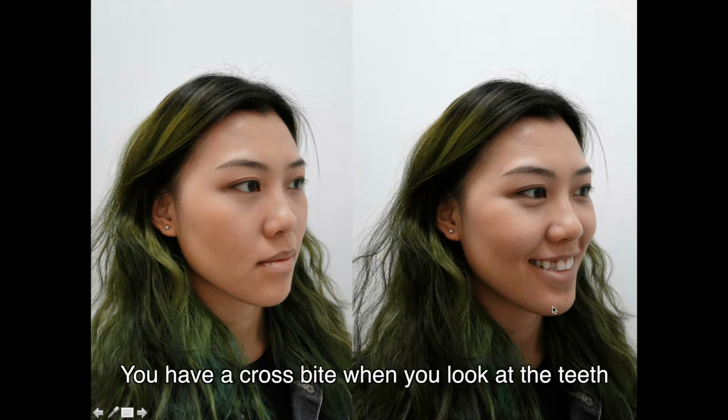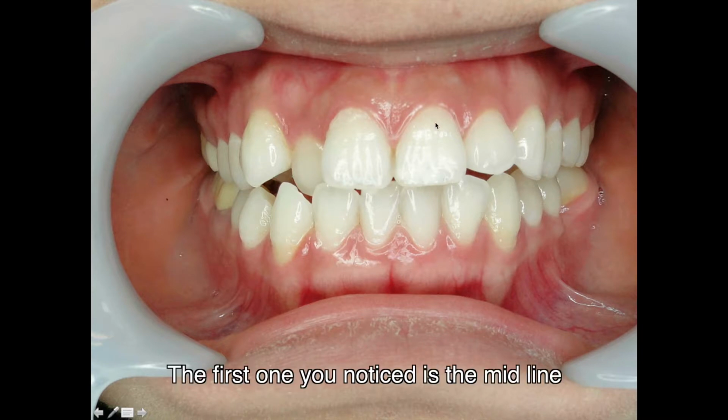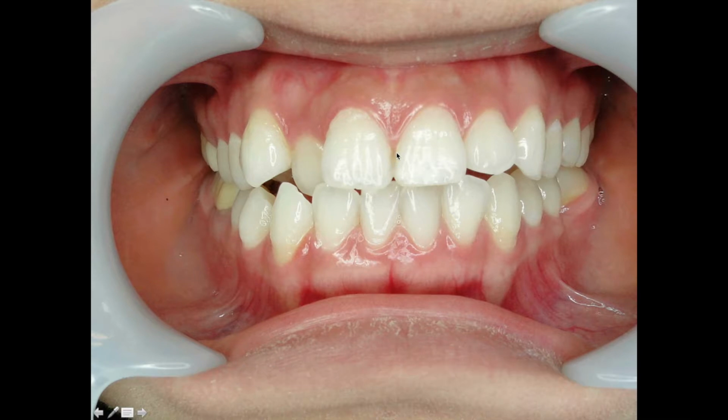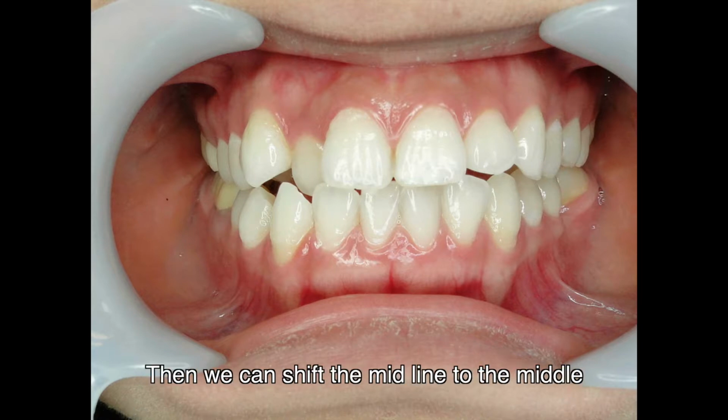We'll look at the teeth. Next. Now this is the teeth. The first one you notice is the midline. The upper dental midline is a little bit to the right. That's because of the crossbite. When we fix this lateral crossbite, then we can shift the midline to the middle.